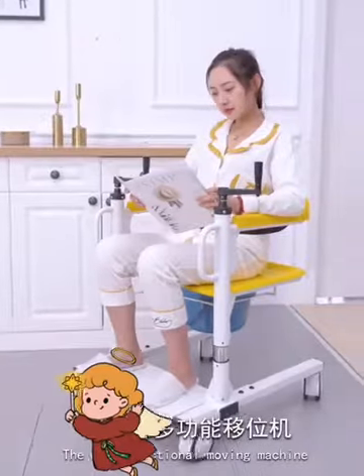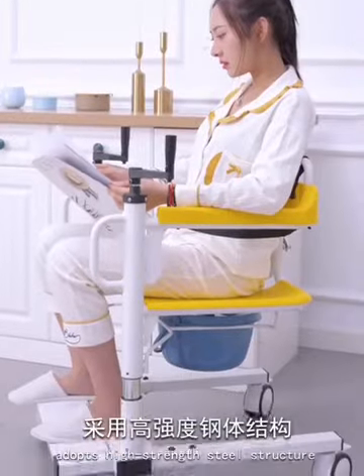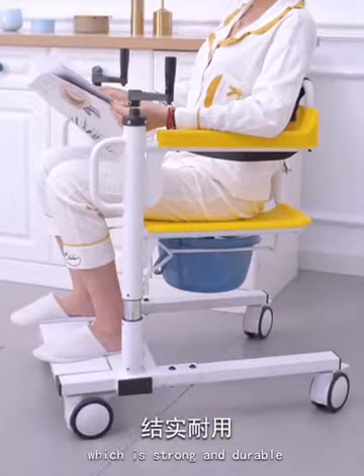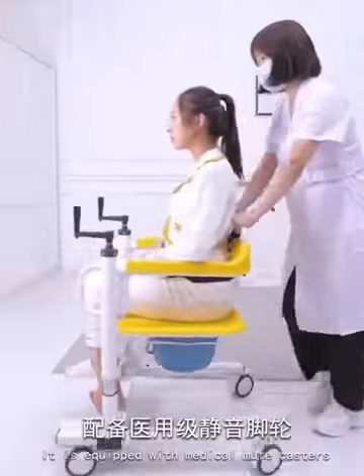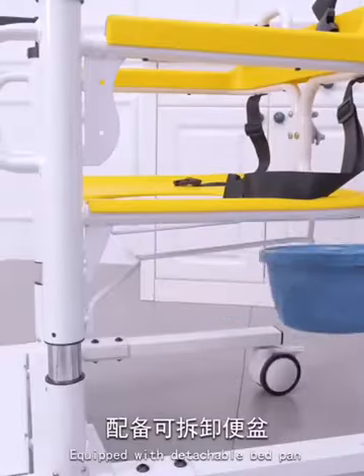The multifunctional moving machine adopts high-strength steel structure, which is strong and durable. It carries less than 100 kilograms. It is equipped with medical mute casters and a detachable bedpan.